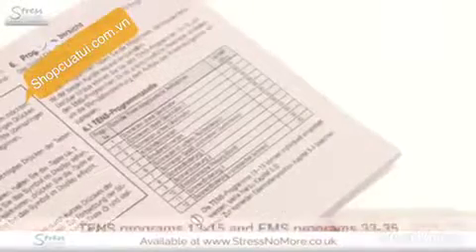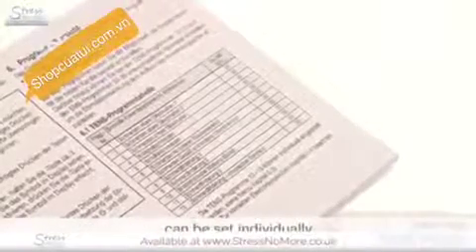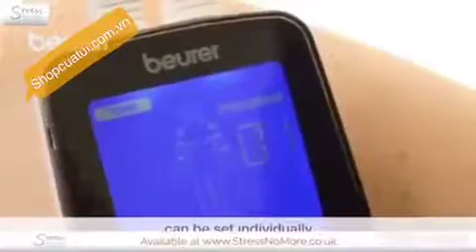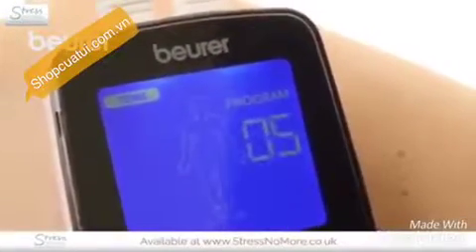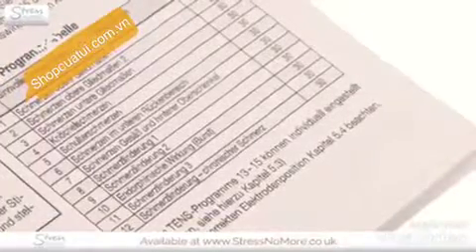The TENS programs 13 to 15 and the EMS programs 33 to 35 can be set individually. The little figure in the display provides information about the possible placement of the electrodes for the selected program. Find the right setting from the program table.